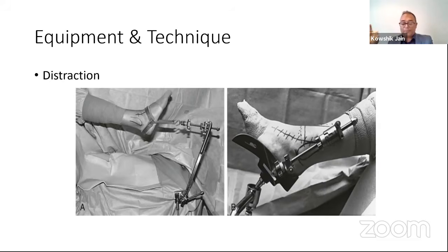Many surgeons trained in that school continue not to use it. The disadvantage of not using distraction is getting into the ankle joint. If you want to examine the syndesmosis, the tibio-talar articular surfaces and the posterior aspect of the ankle, it can become difficult even with a 2.7 millimeter scope without distraction.